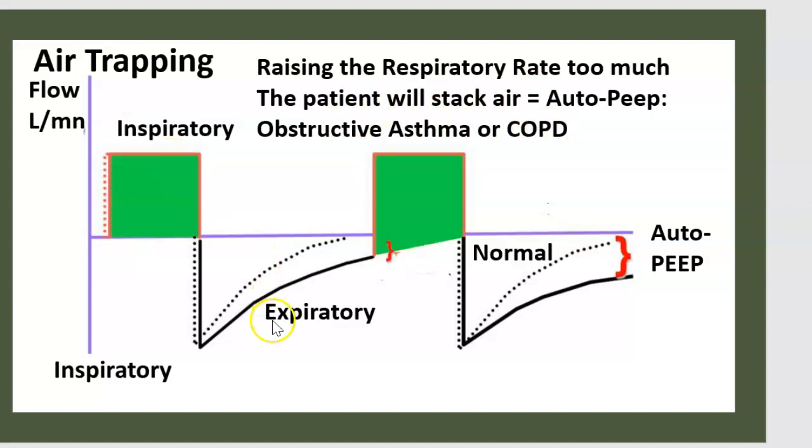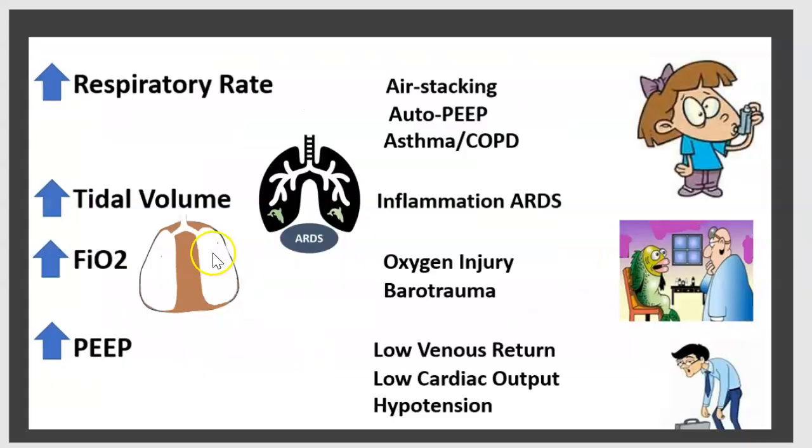Inspiration, expiratory time. Here is the normal, and here is the auto-PEEP. The risk of increasing respiratory rate could cause air stacking, auto-PEEP, or asthma, COPD.